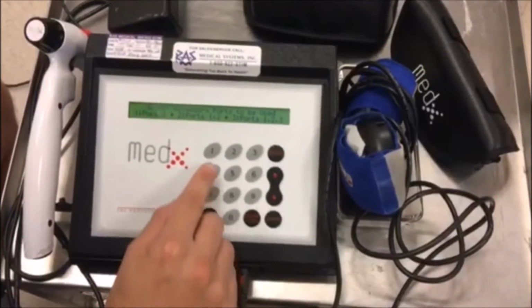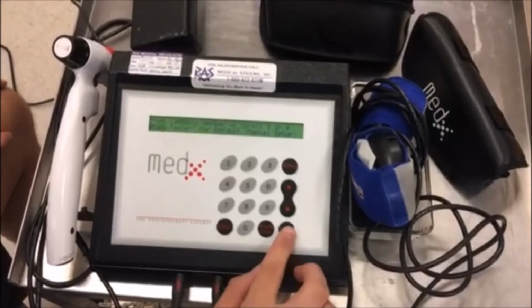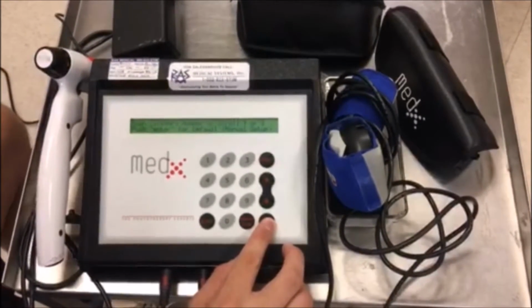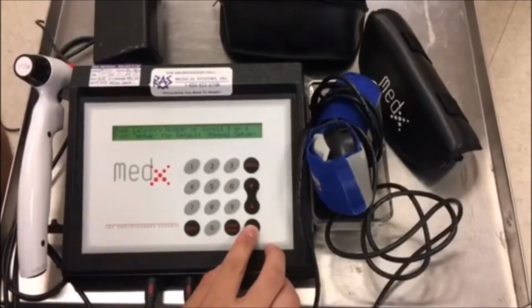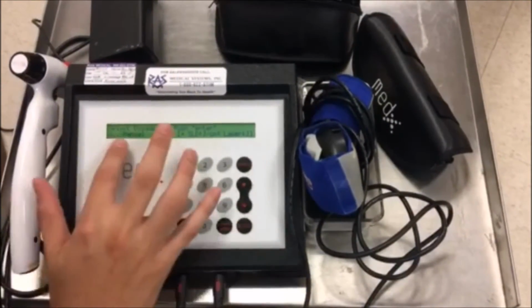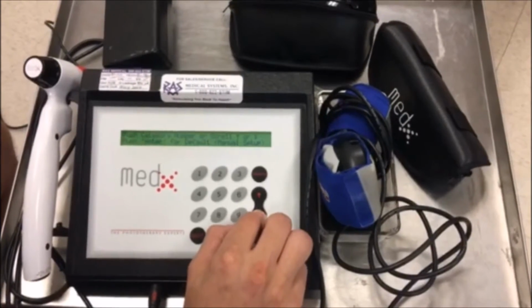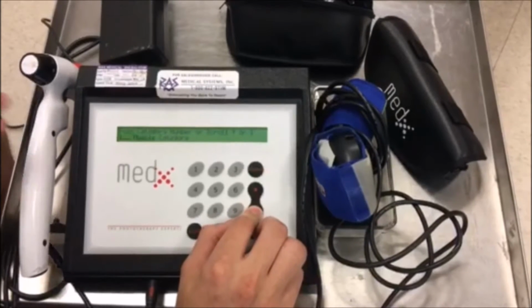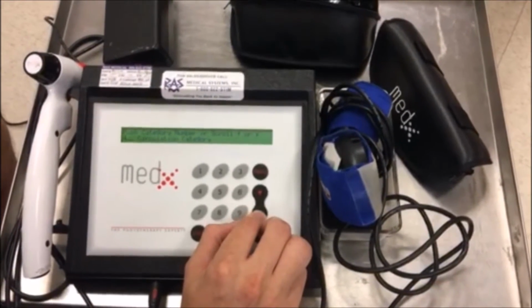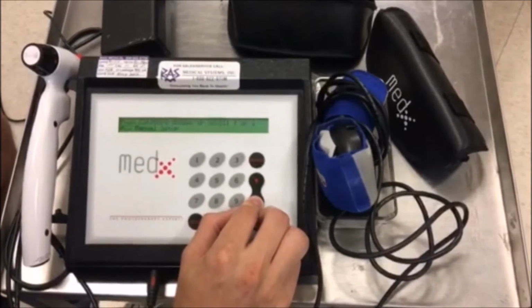So let's say we are treating a patient with port 1 right now. We press 1, and then a new prompt comes up. This prompt says that we can choose different settings. Either manually, we can set our parameters, or we can choose to have set parameters for various tissue. So we hit enter. Here we have our manual setup, where we enter our joules with the keypad. But if we wanted to choose set parameters for various tissue, we would use the arrow keys here, and as we scroll down, 1 is muscle, 2 is for joints, 3 is for nerves, 4 is to promote circulation, 5 is for superficial closed, 6 is for superficial open, and then we're back to manual.